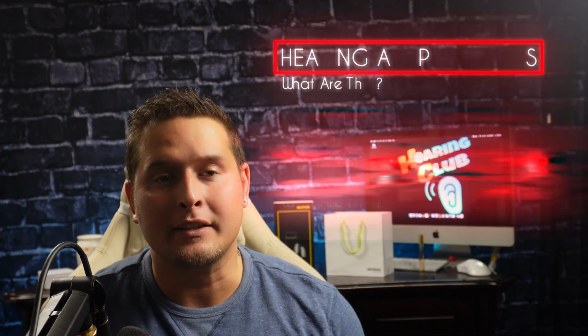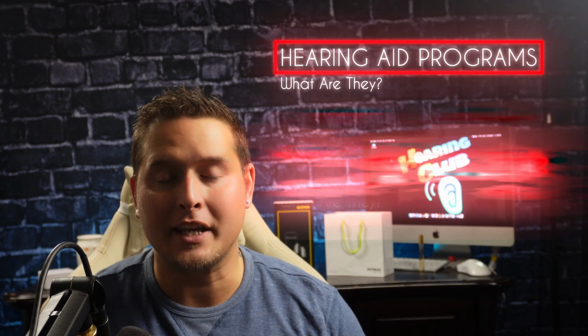So basically, a hearing aid program is a preset of different settings designed to help you in different listening situations or different listening environments. You can switch to these different programs, or I like to call them modes, because they're different modes for different situations.